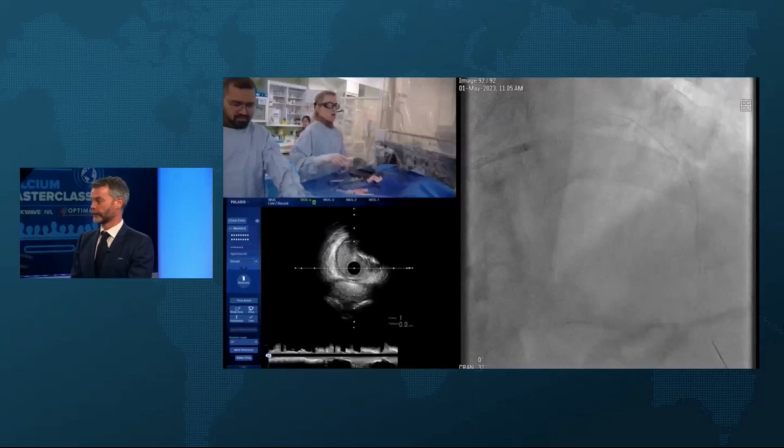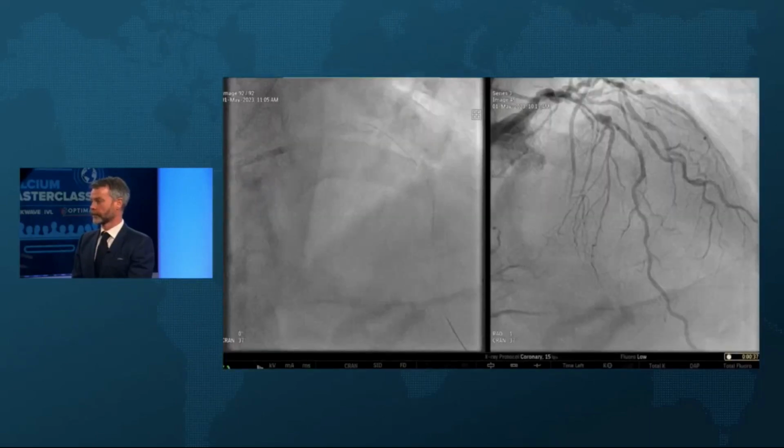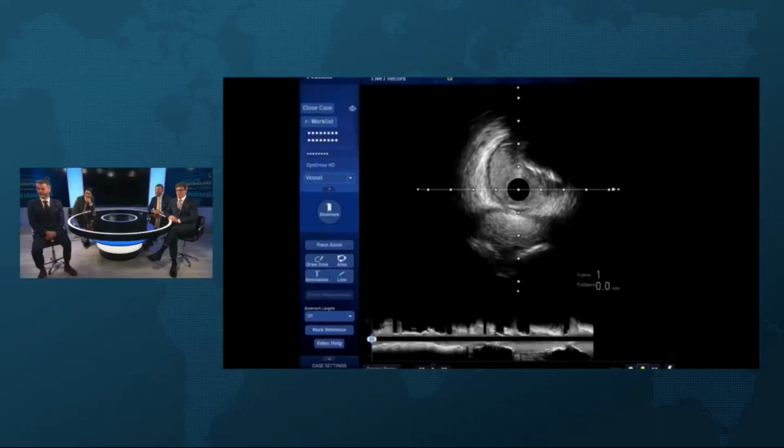Okay. So can you get IVUS full screen? Yeah, it should be possible. Even if you can't go full screen, we can see it well. It's interesting, isn't it? Look at that nodule on the fluoro on the right. Just a classic translucent. Okay, got it? Yeah, we're there.